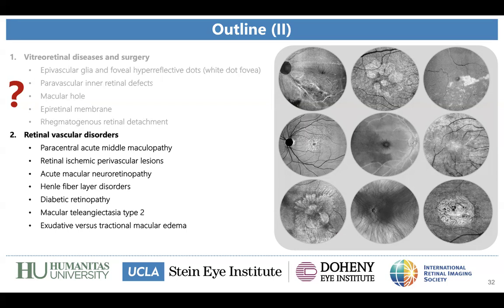I think, also to reply to your question, that en face OCT will be more and more used also to classify these types of diseases, because as you were saying, by only using cross-sectional OCT, we actually miss some information. Thanks to en face OCT and this large view with a single acquisition, we can visualize the pattern of not only the closure type and subtype, but also the presence of photoreceptor disruption and granular hyperreflective dots.